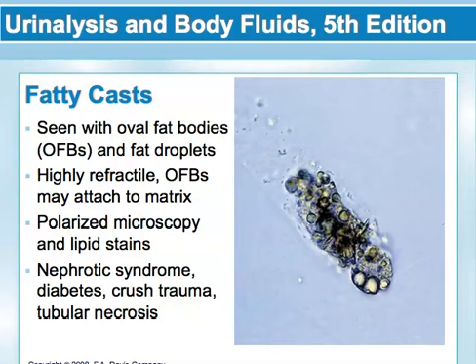These are going to be very refractile. The cast matrix can contain fat droplets and oval fat bodies. Confirmation of these casts can be made with a polarized scope and your lipid stains, so either Sudan 3 or oil red O.